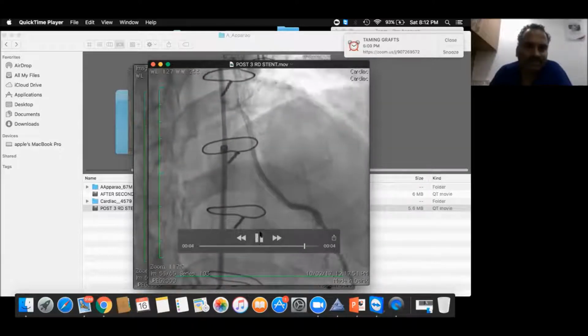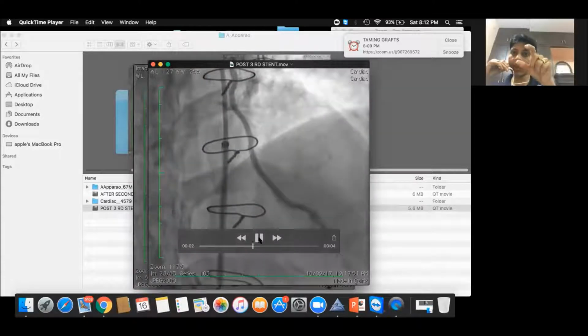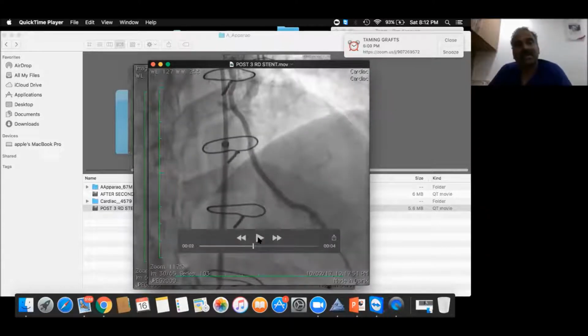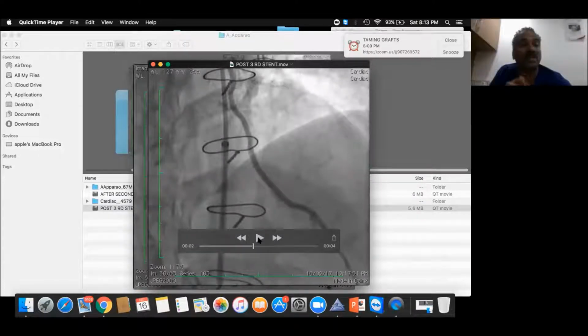Is that looping due to an inappropriately chosen length at the time of surgery, or does it happen even though they choose the appropriate length at the time of surgery? And it is very difficult. See, a loop which is visible in one view sometimes disappears in the other view. Understand? At the time of surgery, they will be visualizing it. You mean when the loop is formed? Is that what you are asking?